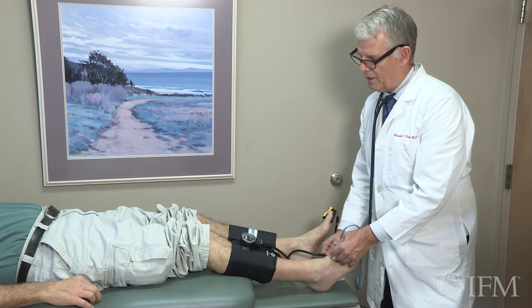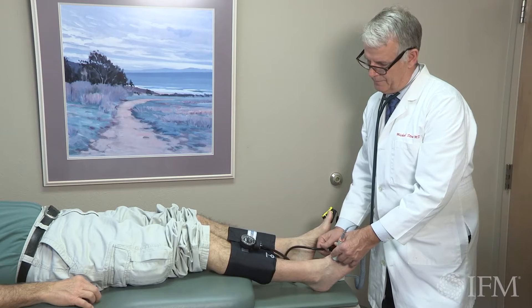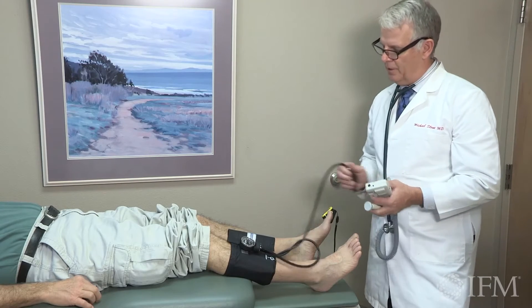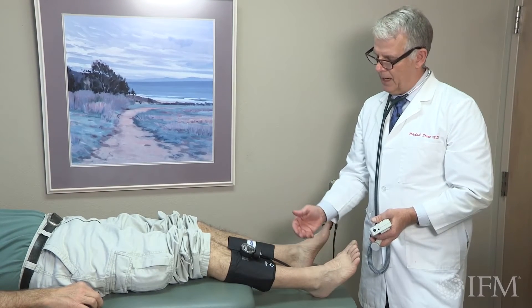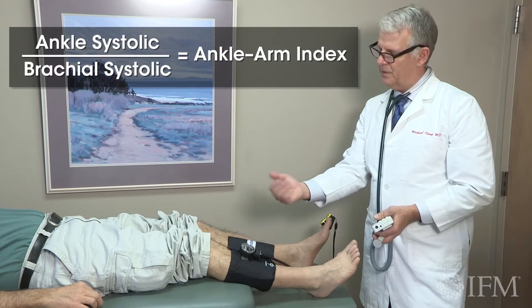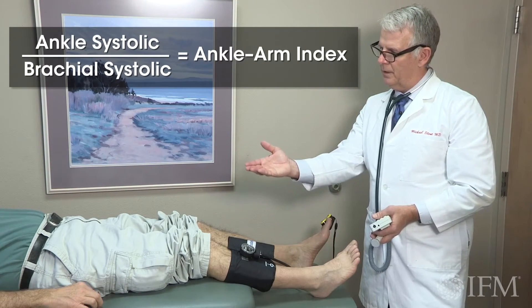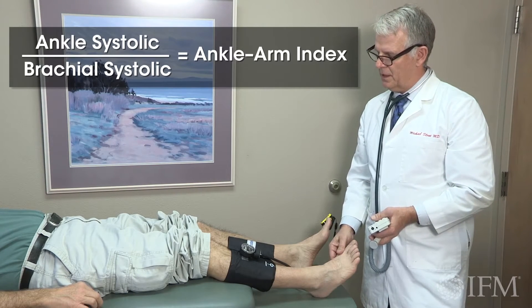You start hearing at 142, it's most dominant at 112. Now we'll check the upper arm, the brachial artery. And we will be able to calculate the ankle brachial index, or the ankle arm index — two different terms for the same thing. We will take the ankle systolic pressure and divide it by the arm systolic pressure to calculate the ankle brachial index.